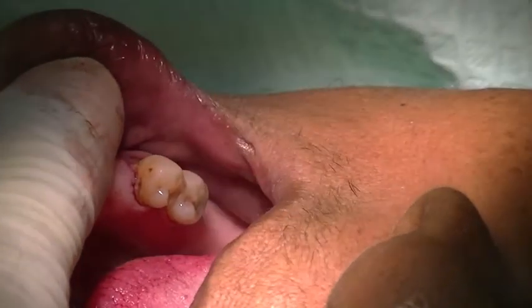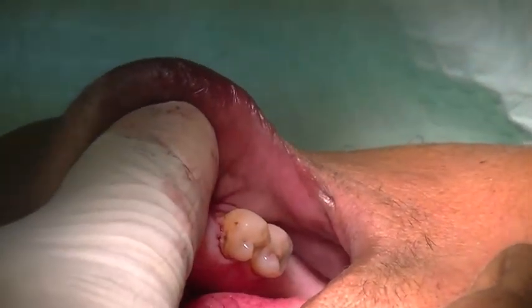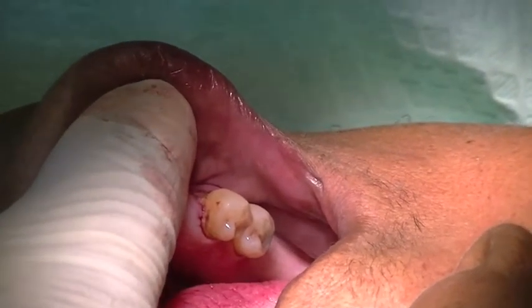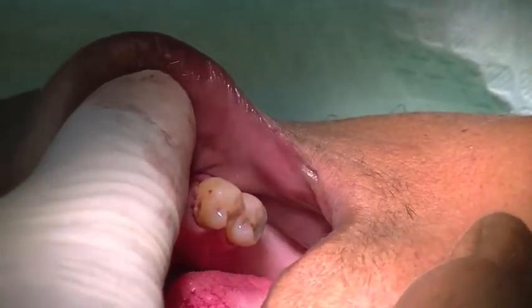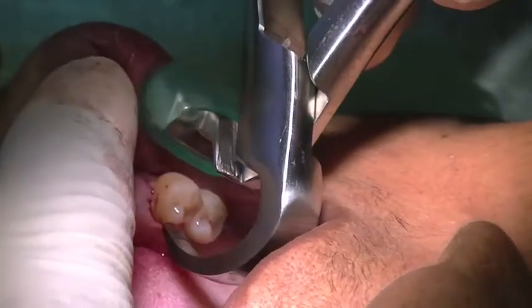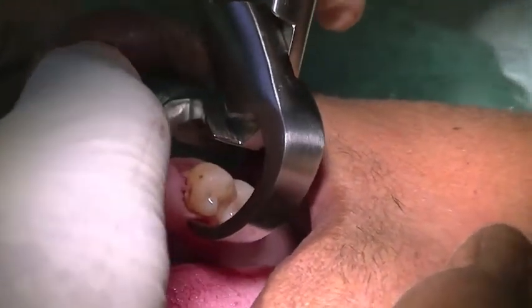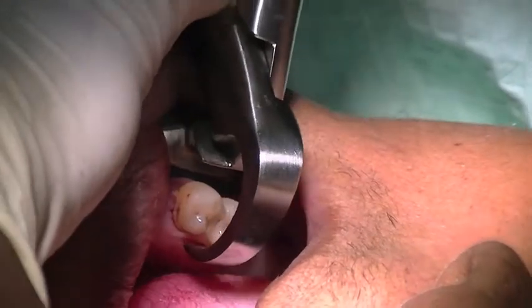We've already separated the gingiva with the periotome, so we're going to apply the forceps. Again, placing the beak as far apically on the lingual side as possible, and the bumper resting in the vestibule.